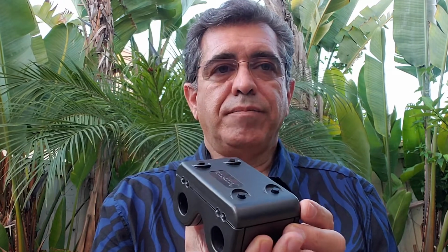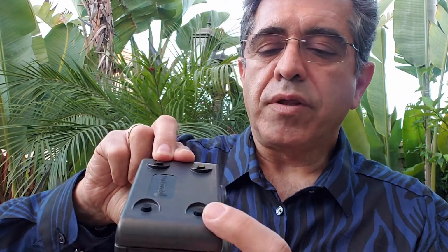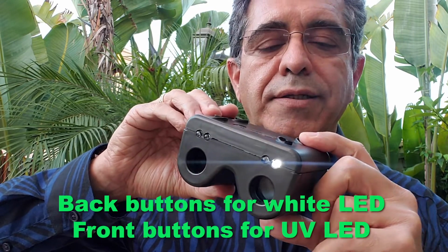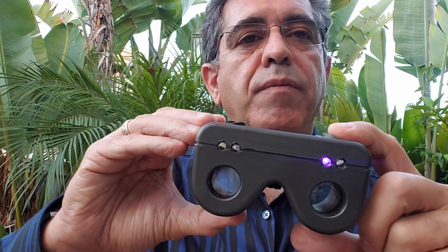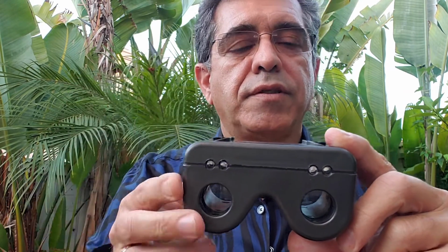There are two other lights incorporated in the APD tester. These are controlled by the buttons in the front. So the back buttons close to the oculars are the white lights, and the front button actually controls the other light, which happens to be a blue UV LED light. And there is one on both sides. They are designed for examining the cornea or conjunctiva after instilling some fluorescent dye.